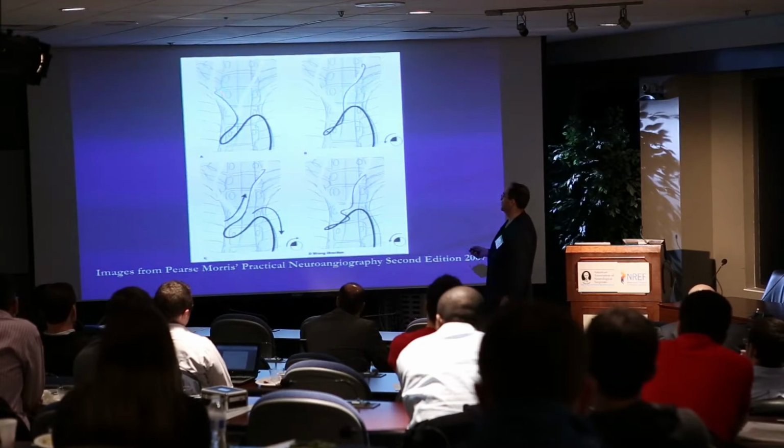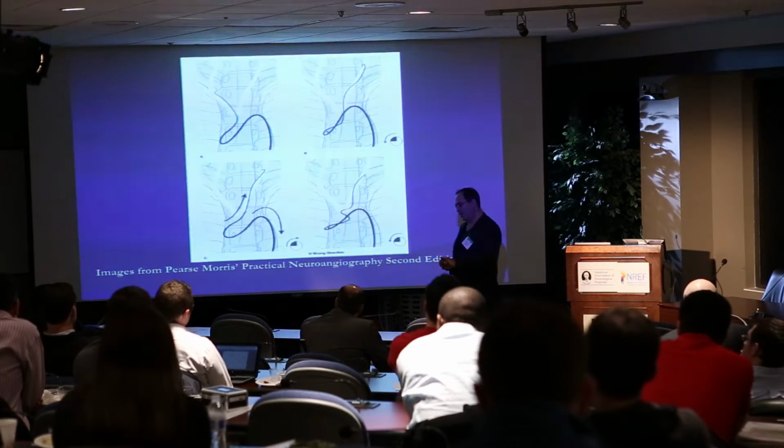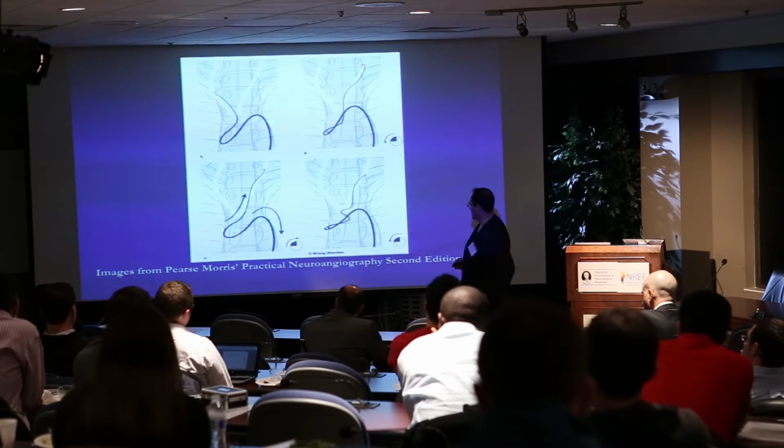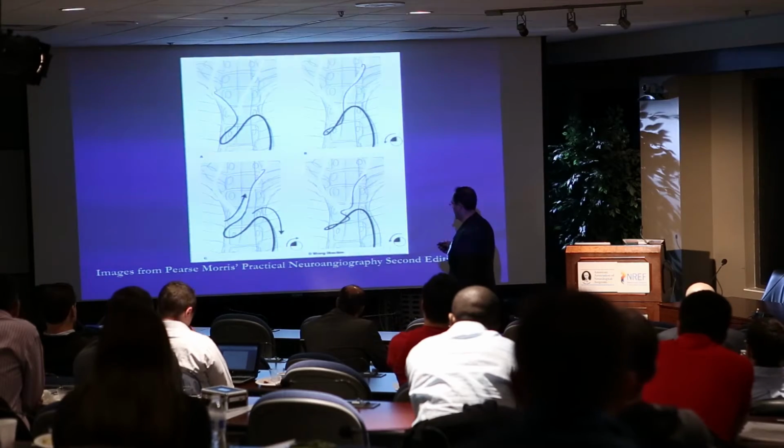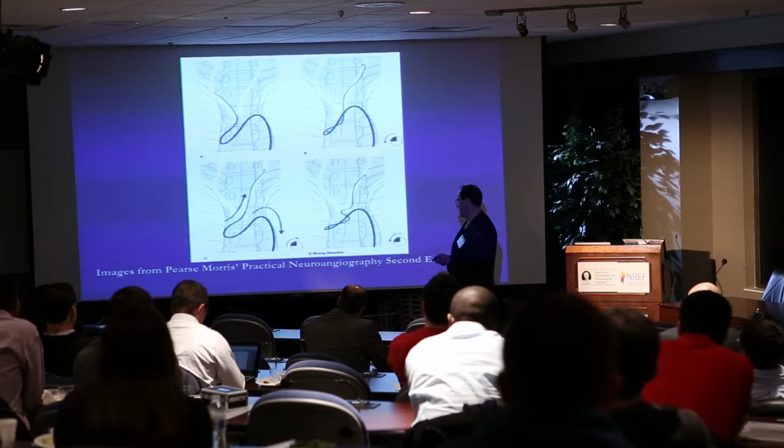I was always taught to do it this way: go into any vessel that I could to form it, and then, as you know, you turn it to get access into the left, and then you pull on the Simmons, which is a little different from pushing the regular Tempos or Berensteins, and that will advance the catheter. When you're ready to take it out, you push, and you never pull the Simmons out without a wire in it, because it can get twisted and stuck in your short groin sheath, and then you have a real problem getting it out. So that's about using the Simmons.